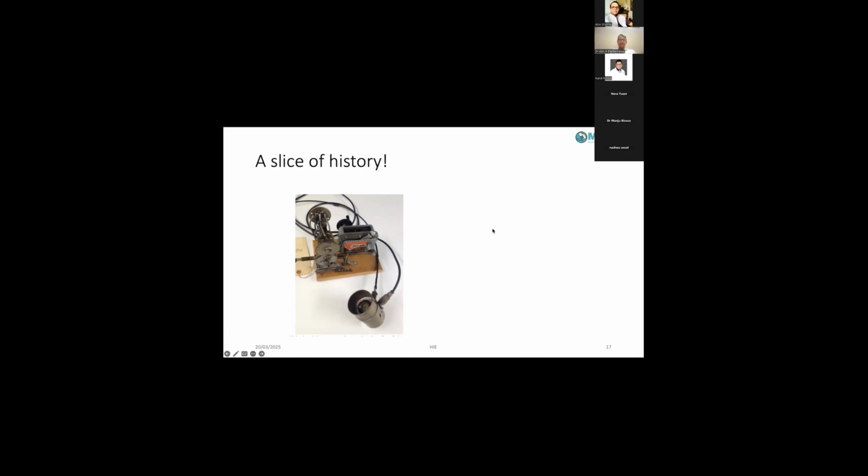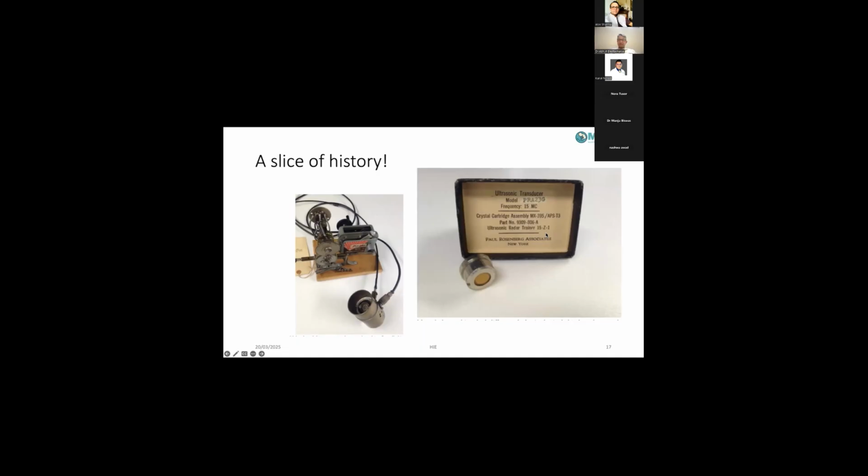In the sense, that's the ultrasonic transducer, right? So piezoelectric crystals had been placed here, and they started using it as a kind of portable ultrasound machine. From that big tub filled with water, this is where we reached, and this is from the 1980s by Paul Rosenberg Associates in New York. So, ultrasound machine.